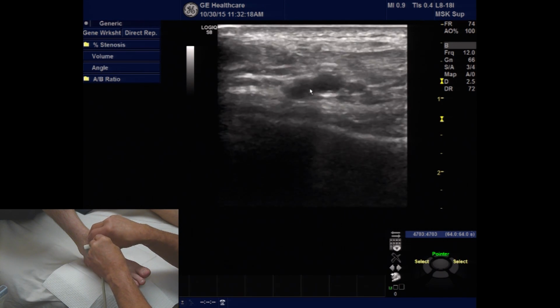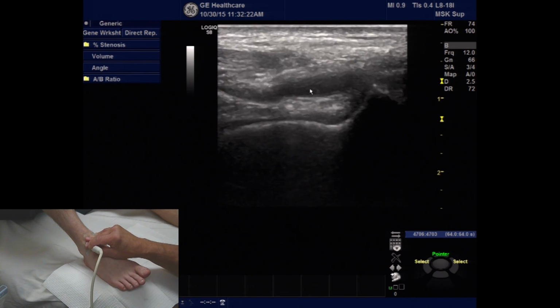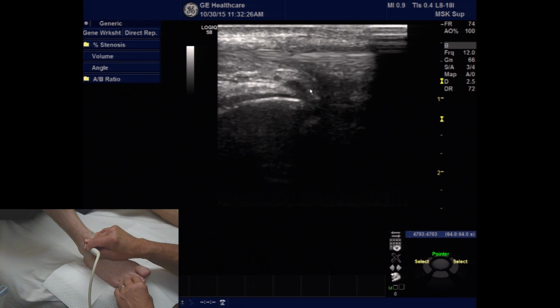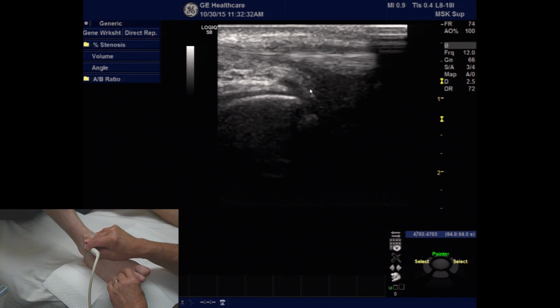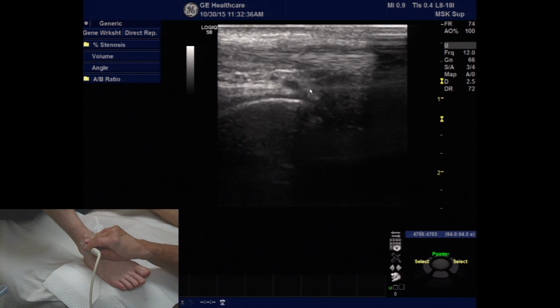Rotating the transducer once again into a long axis, we want to assure that we're looking at the proper tendon structure. So by moving the toes back and forth, we can actually see the digitorum sliding back and forth, and that way we can be assured of what tendon structure we're looking at.